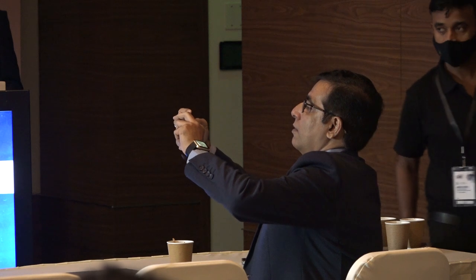Just for doing this maneuver of massaging, please go back to the old days, use the Landers lens, central lens, place it on the cornea, do the massage, so you will not injure the retina. And absolutely no complications. And what's the biggest macular hole you have operated by this technique? 1600. 1800 by macular massage only. Great. Okay, Dr. Dharmesh.